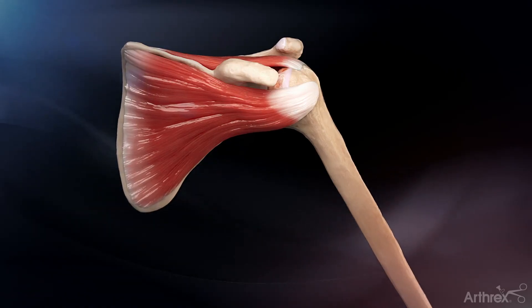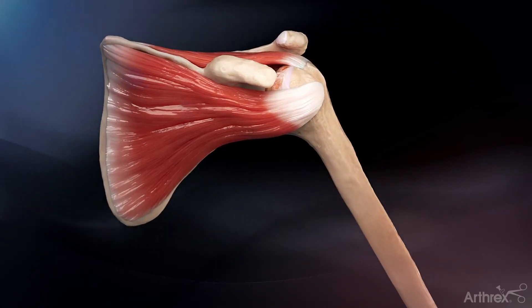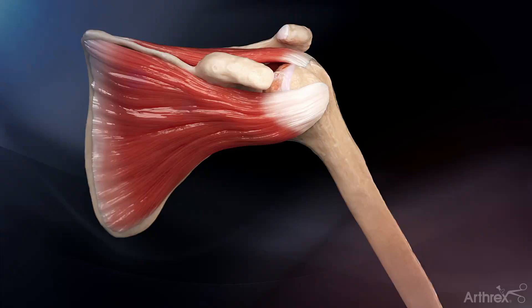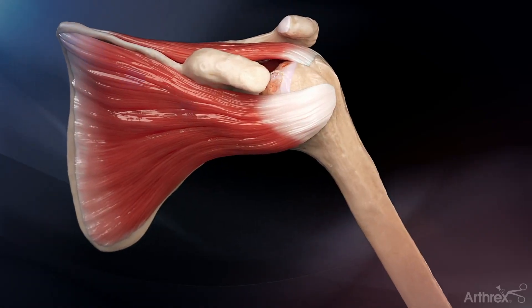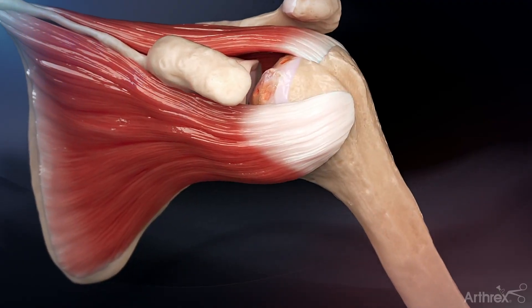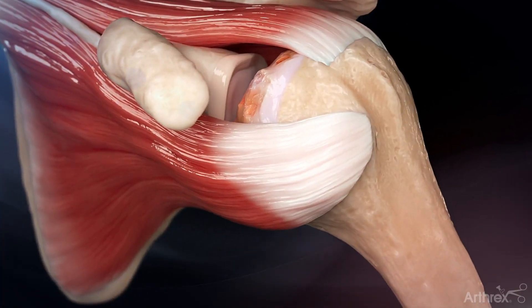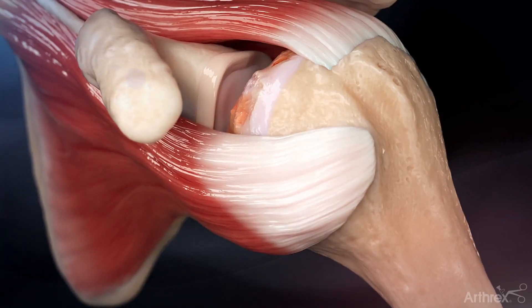The fiber tape tendon compression bridge technique may be utilized during total shoulder or hemiarthroplasty procedures as a method of repairing the subscapularis tendon. It may be used when either a subscapularis peel or lesser tuberosity osteotomy is employed for the subscapularis takedown, although this animation shows use with the LTO method.